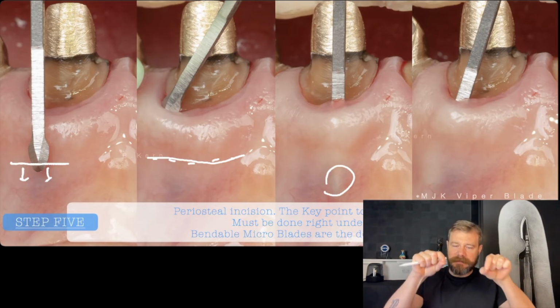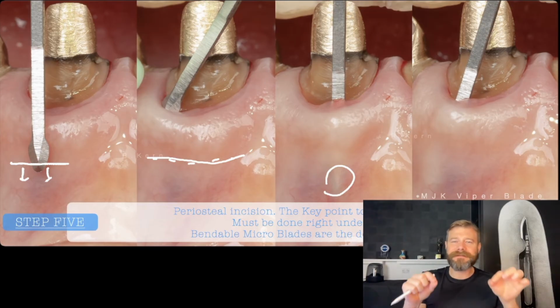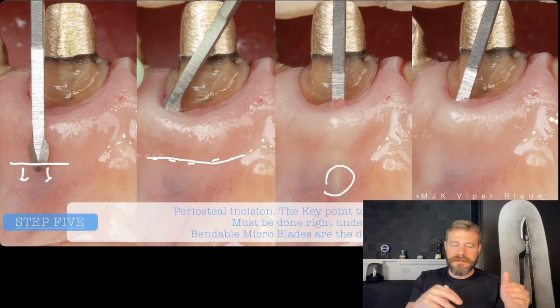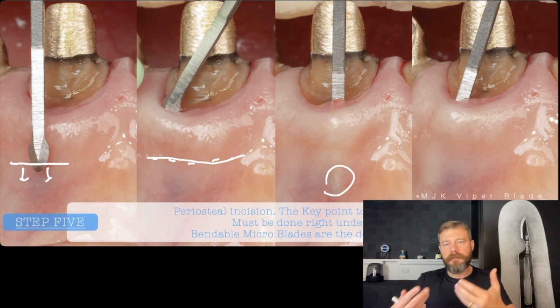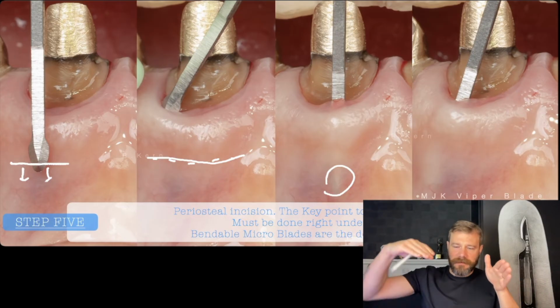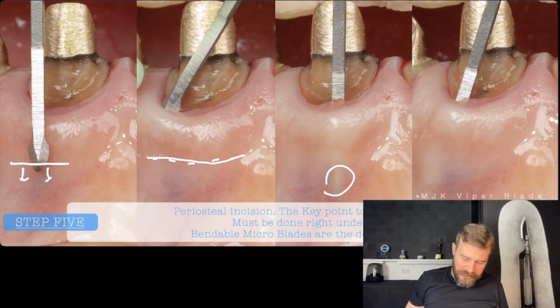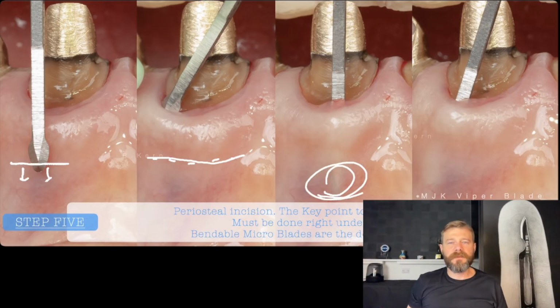The releasing, when you bring the flap with some muscles together, is not the same. And of course, if you have some muscles on the flap, on the post-op, the muscle is going to keep moving the flap, or can move the flap. If the work of the blade cuts the periosteum and goes exactly to the surface of the mucosa, exactly as we are looking here, okay?